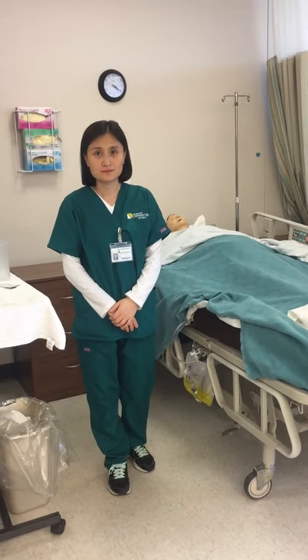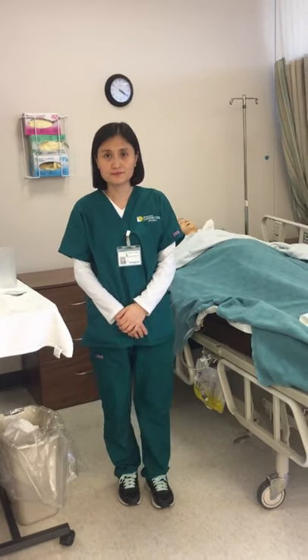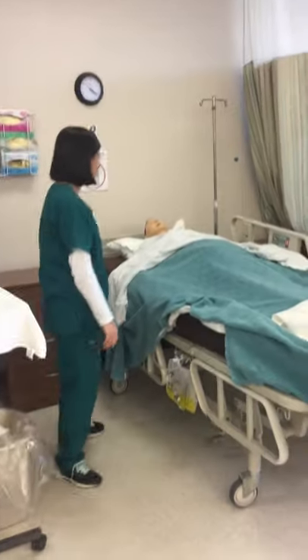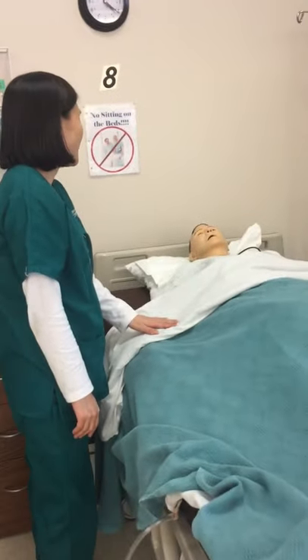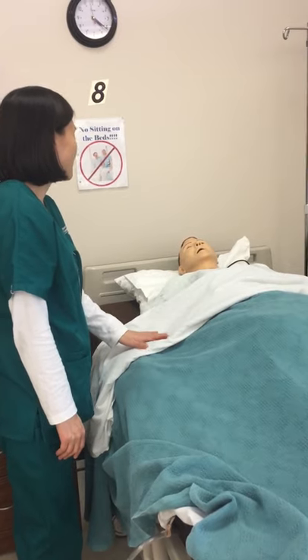Kirsten is videotaping Eugene emptying a Foley catheter bag. Eugene introduces himself: 'Hi, my name is Eugene. I'm your nurse today. Would you verify your full name and date of birth, please?'